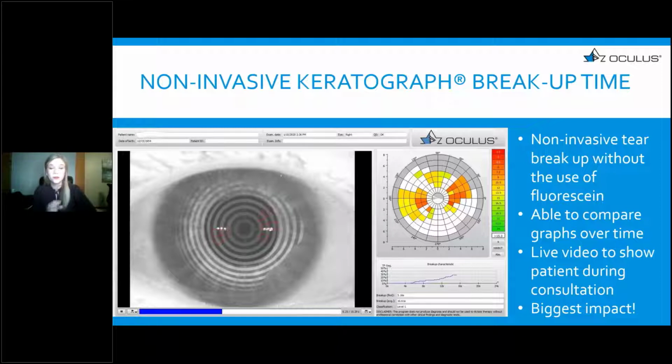And I'm sure right about now, your eyes are getting pretty irritated and blurred and burning. And they say yes. So then I show them, this is actually mapping out areas where the tear is evaporating from your eye. And that is a great visual for them. And they say, wow, that makes complete sense.